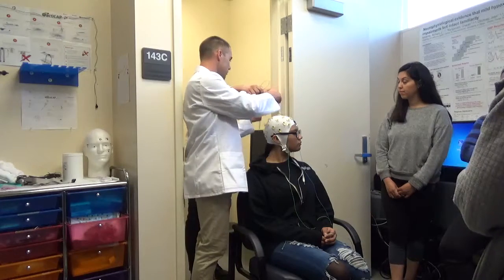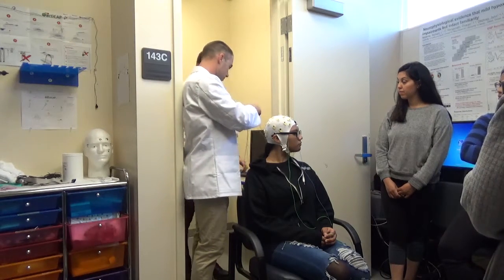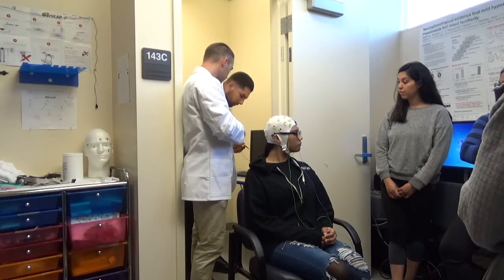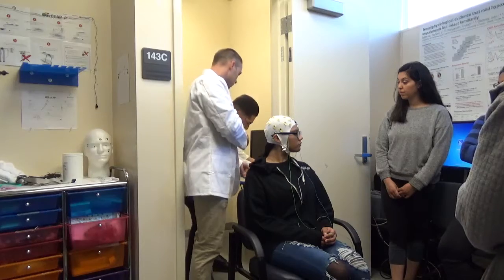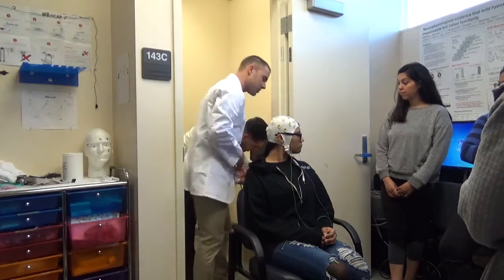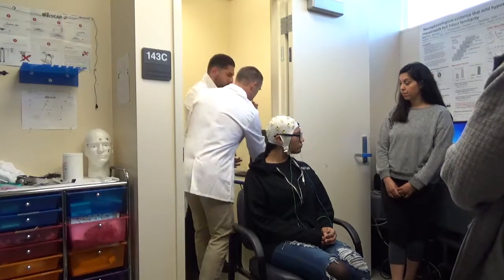So I'll hold this if you want. And you can plug those in. Take it one at a time. Here. Oh, here's one. So let's say the green one is up, vertical ocular.